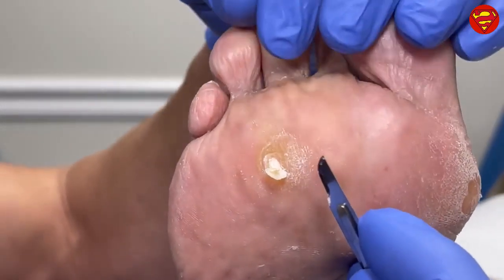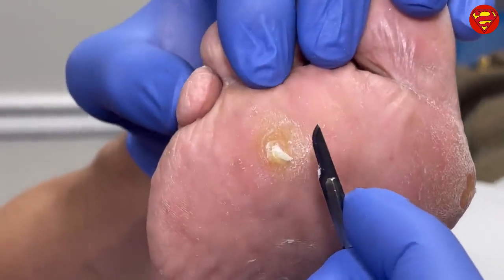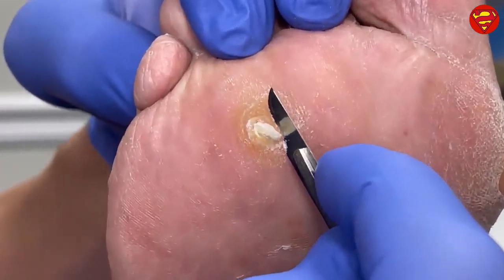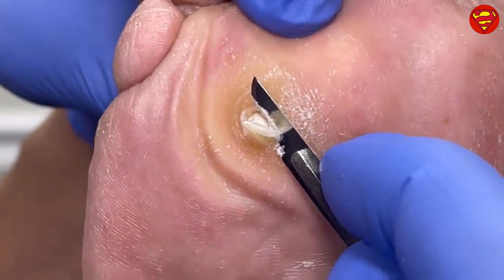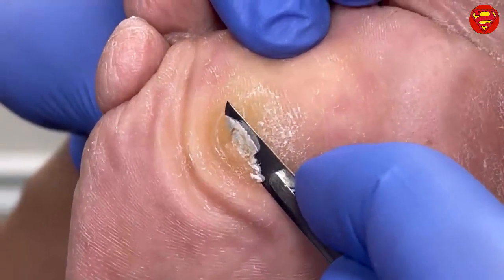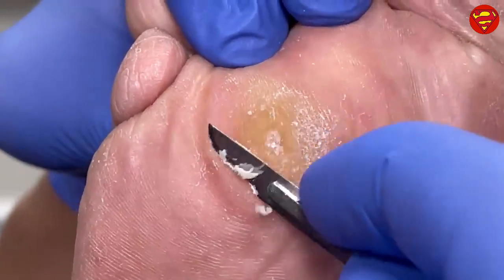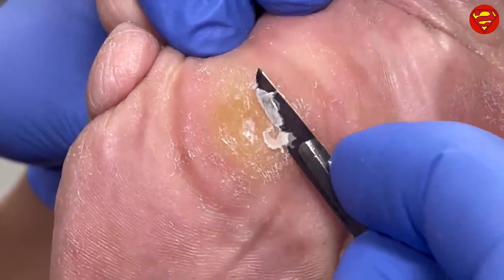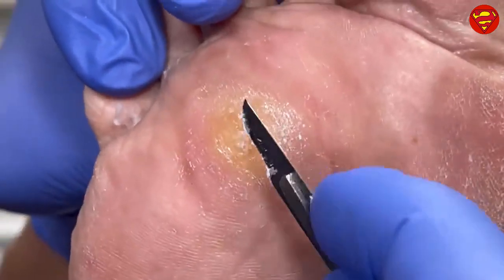We did offer the patient a little bit of local anesthesia, but the patient deferred. The patient did not want that. ¿Está bien, Mimi? So we'll take out the initial cap, the top cap. Lo único que no le pido es que no mueva el piececito. Okay?